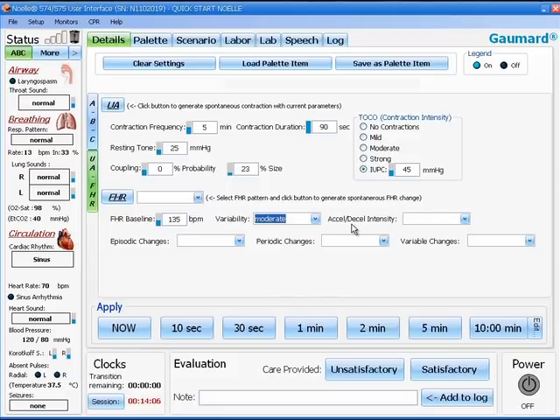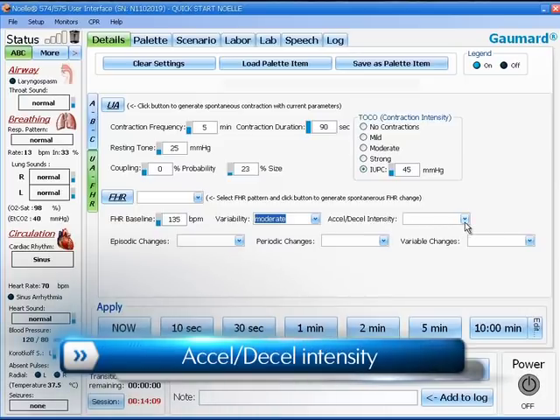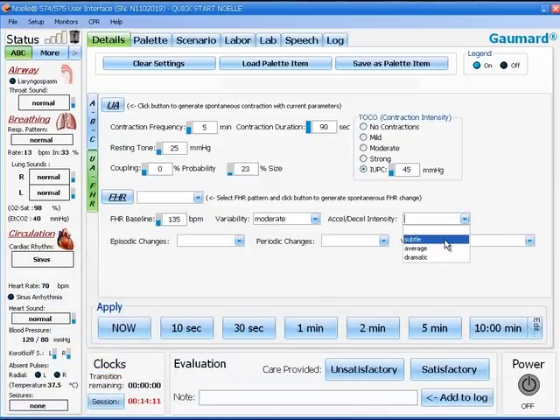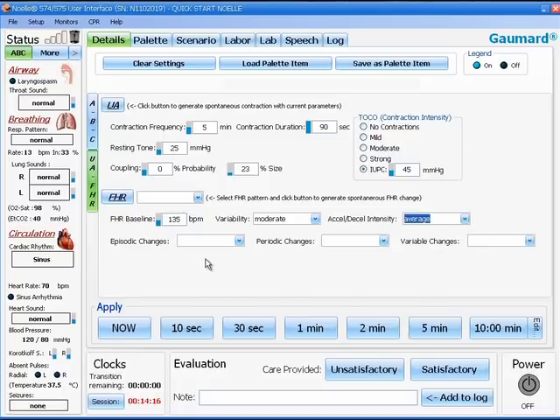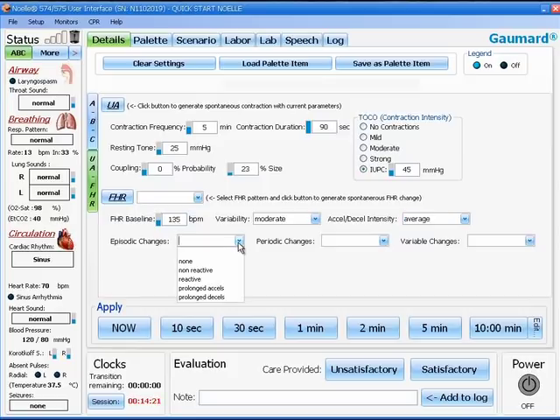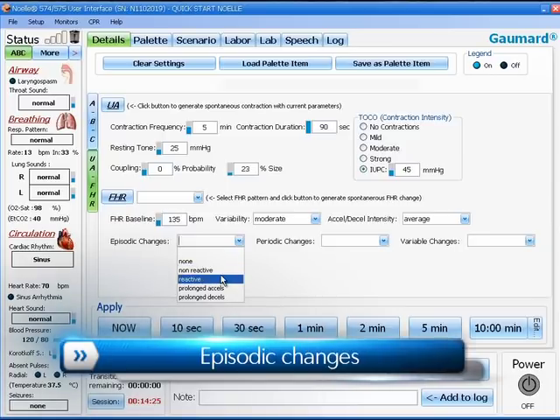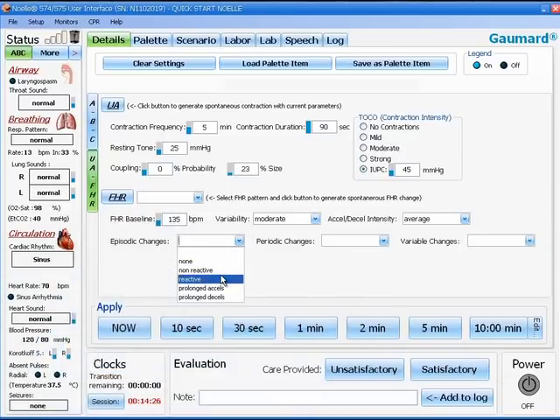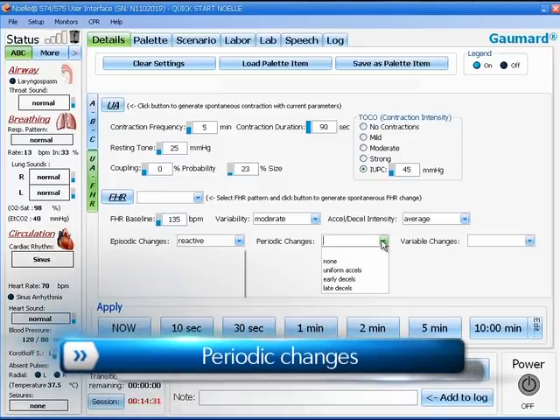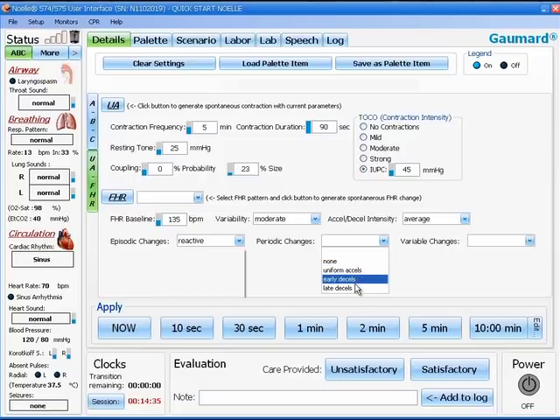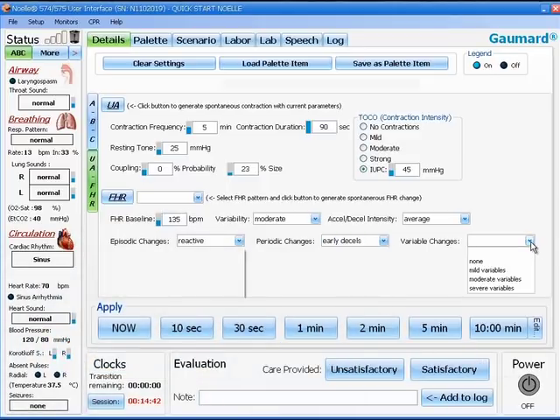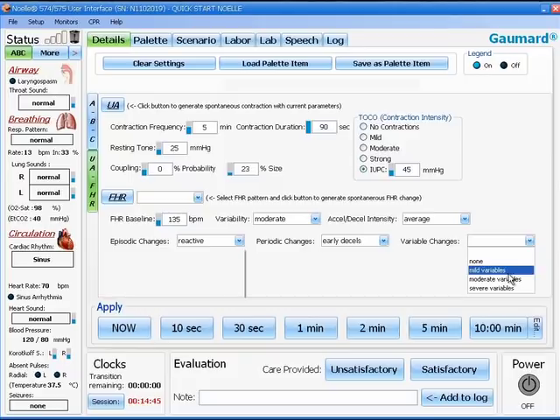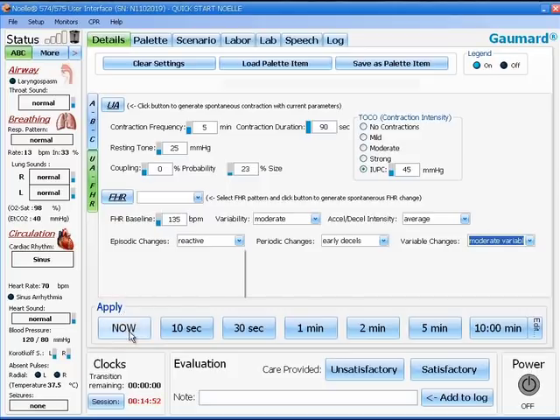Further over to the right, we have our acceleration and deceleration intensity. They will be a choice of subtle, average or dramatic. Going down to the lower level of boxes, our first one on the left is episodic changes, where you will enter things such as reactive and non-reactive. Next, we have periodic changes. Things such as early and late decels are entered in this location. And finally, we have variable changes. Here, we can set mild, moderate or severe variables. Once we apply all of the changes we have made here, you will see the changes reflected on the fetal strip.